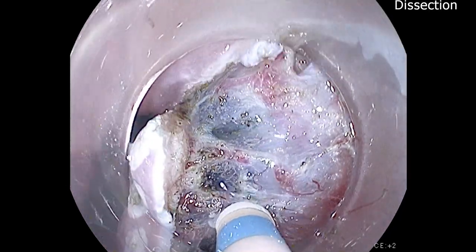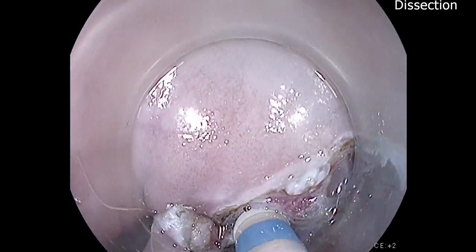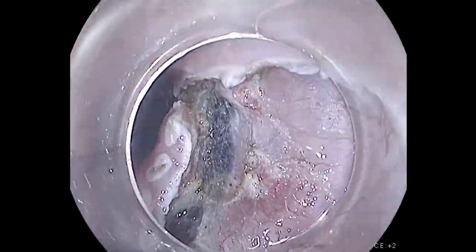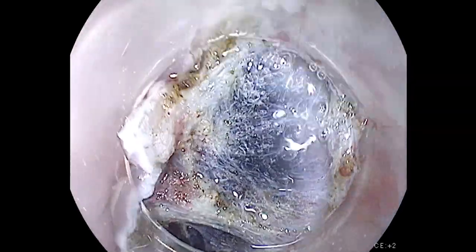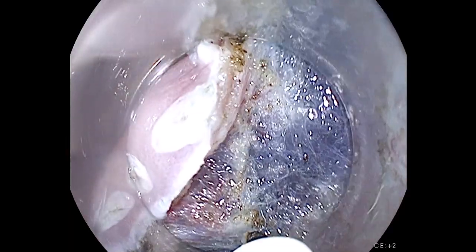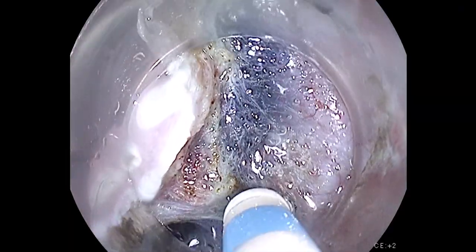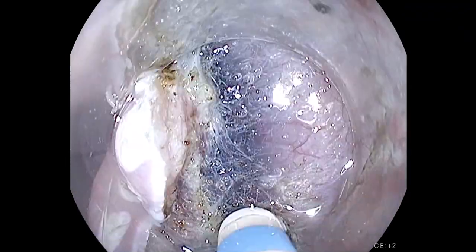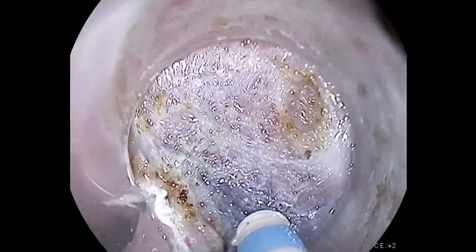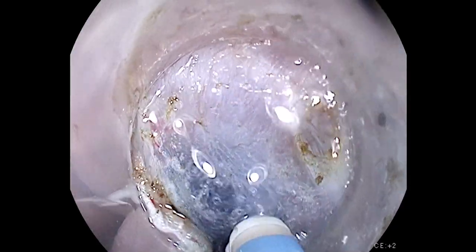Since there was suspicion of submucosal invasion, a deeper submucosal dissection was performed. We can also appreciate the utility of the transparent distal attachment, which allows for traction to be applied to the submucosa while maintaining a good working space. The injection of the knife is also demonstrated, allowing for a quick and effective submucosal injection to maintain a safe dissection plane.